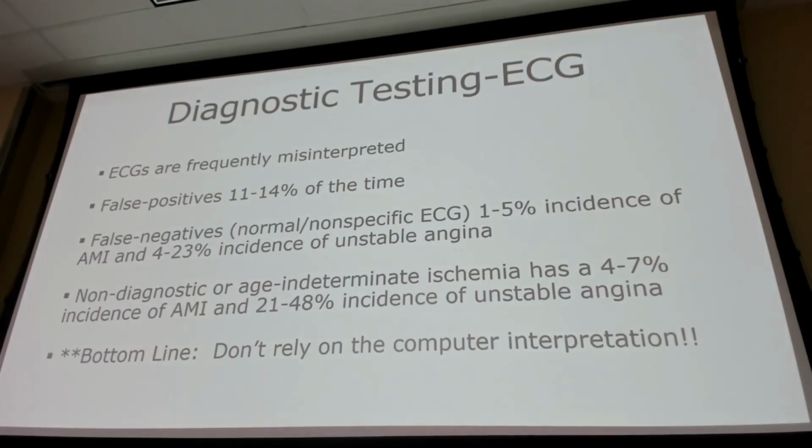They correlate well. But the bottom line, don't rely just on the interpretation yourself. You want to evaluate that EKG because it does miss some things on there. Especially if you're worried about some of those arrhythmias, it may misinterpret it.